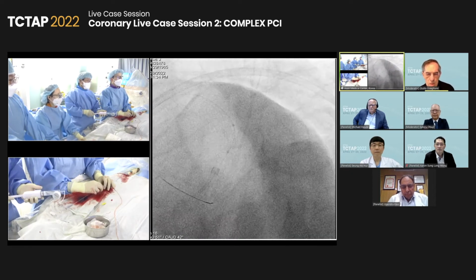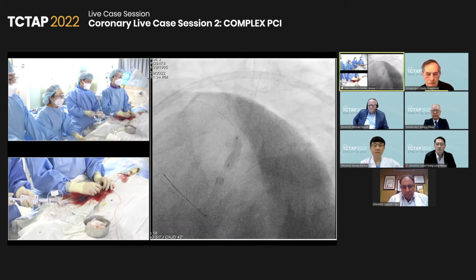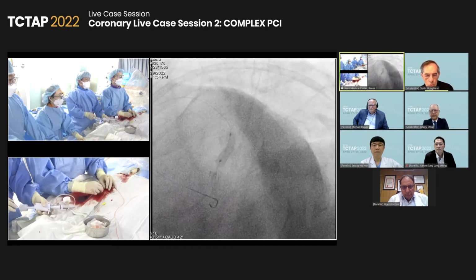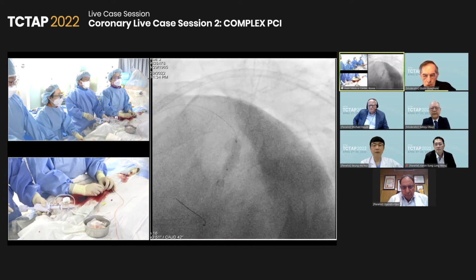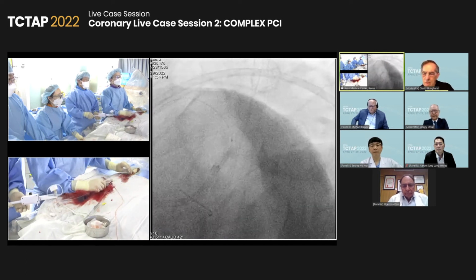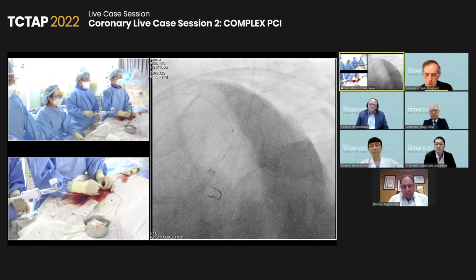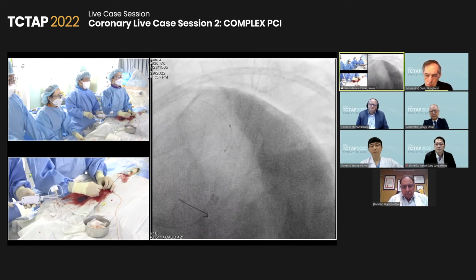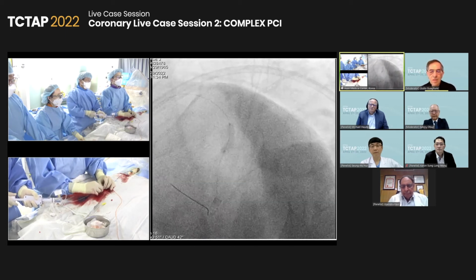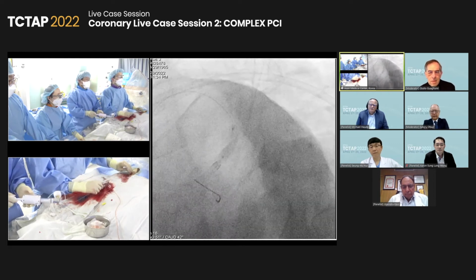What is important is the lumen. Otherwise, you need to use different techniques for preparing. Now it seems that the lumen is bigger, but you still have this asymmetric calcification. We need to be very careful, because when you have a persistent asymmetric calcification and you insist and keep growing the balloon, you can also rupture the vessel. So it's a very tricky situation. Please go ahead. Yeah, I fully agree with your opinion.